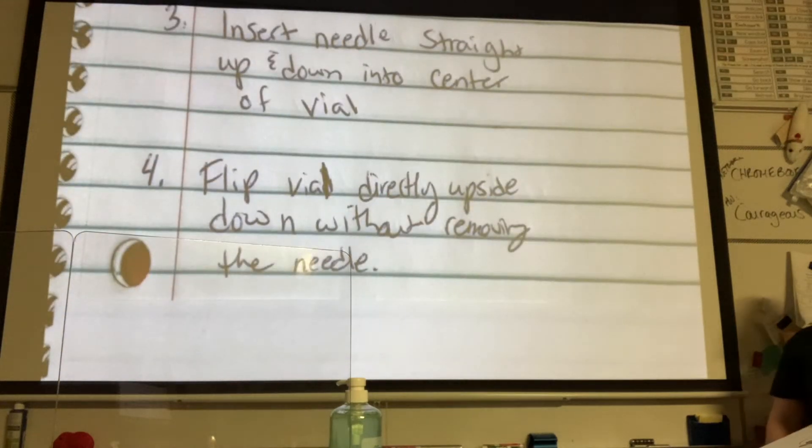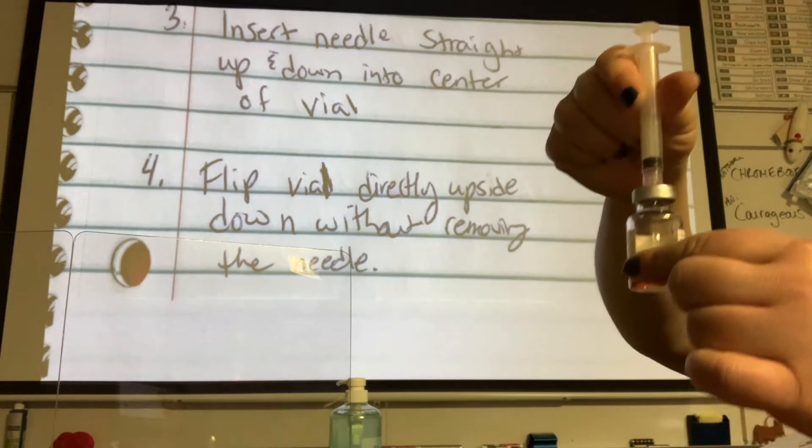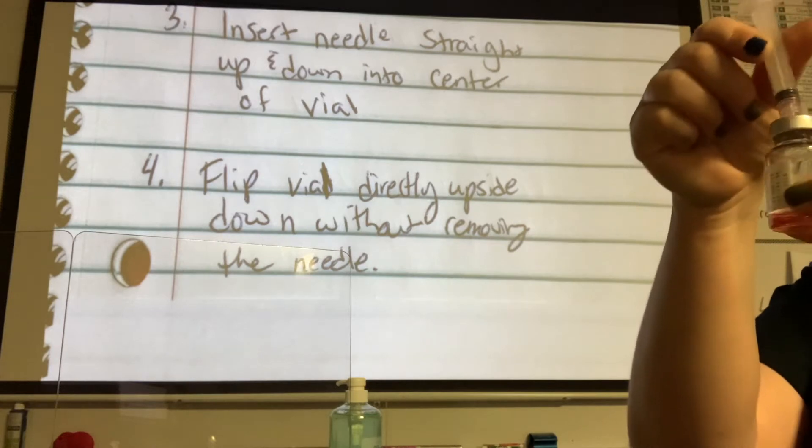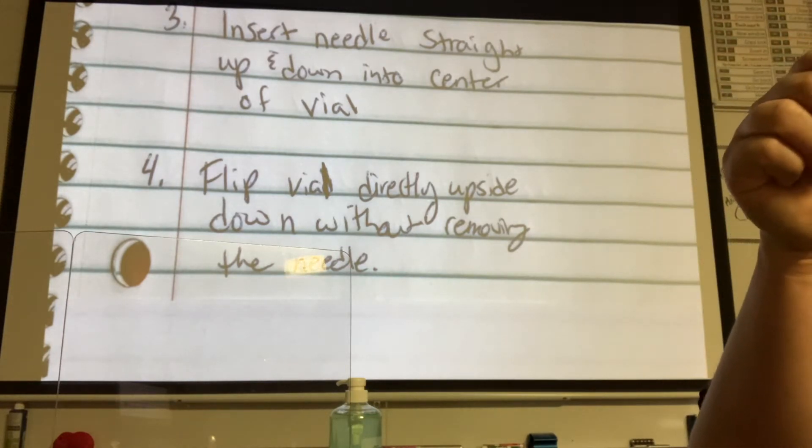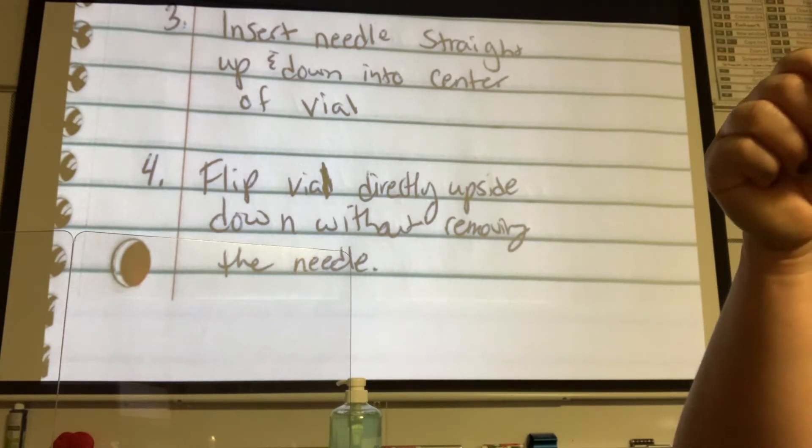Step four. The student places the bottle upside down in one hand and hold securely. So we're going to make sure that we flip that vial directly upside down without removing the needle. Now, once we have the needle in, it becomes much easier to do so. So I'm going to have that straight in, right? And then I can do a few different things on moving it and rotating it up. For this, I'm actually going to show you how to do it without the needle in it first, because it's going to be more difficult, which means when you actually get the needle, it'll be a lot easier.